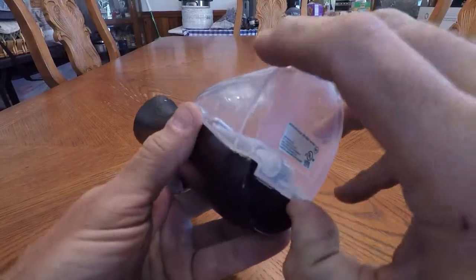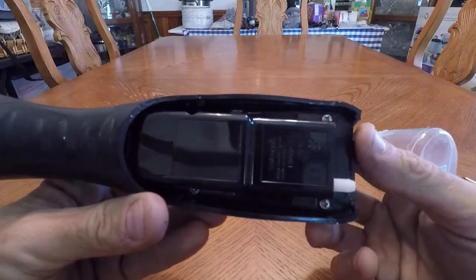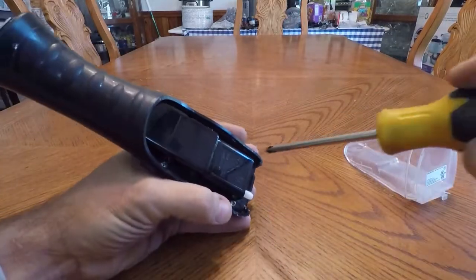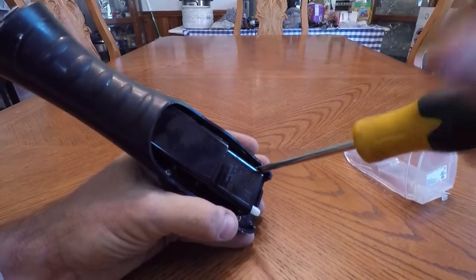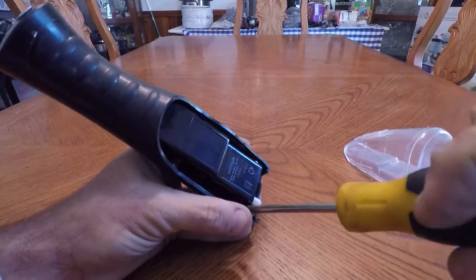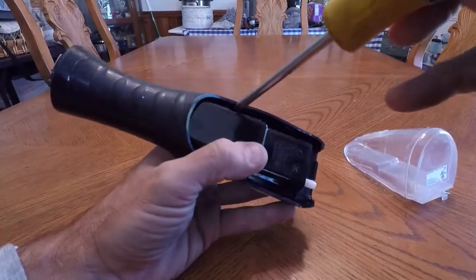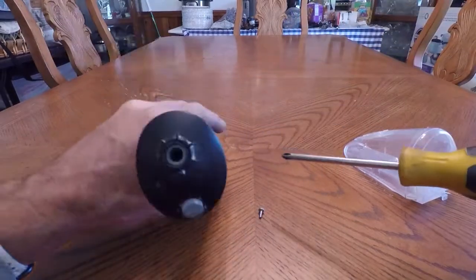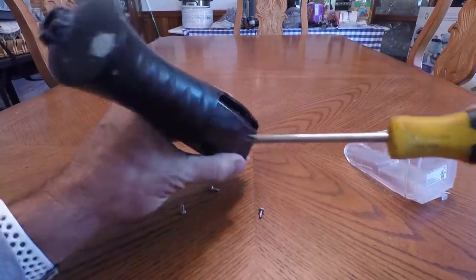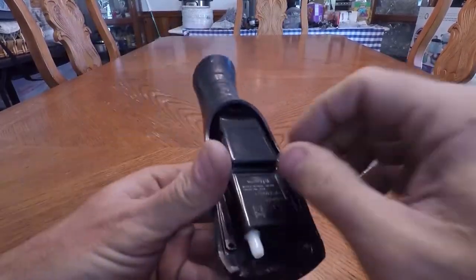Looks like the first thing you do is pull up on that, and that just pulls down. And we've got four screws. Take those out. One of these days I'm going to stop being cheap and get one of those little small battery electric screw guns — they look like they're a lot of fun. Alright, that's all four of those.